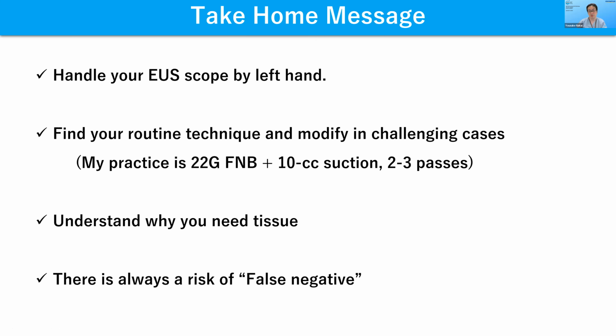And you must choose the right needle, FNA or FNB, small or large needle, based on why you need the tissue. And there is always a risk of false negative. So we should repeat EUS FNA or that technique if it's negative when you think it's clinically malignant. Thank you for your kind attention.